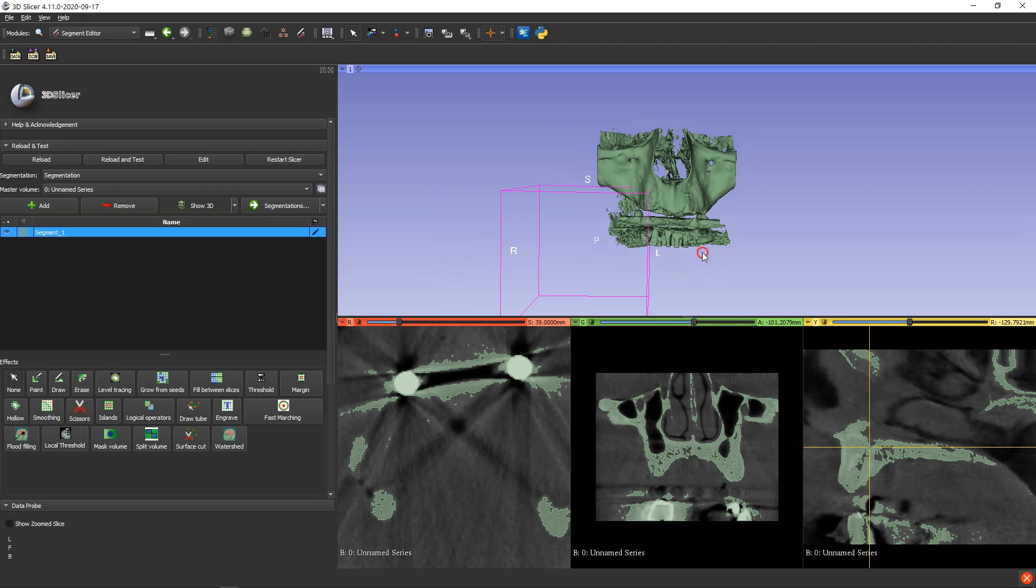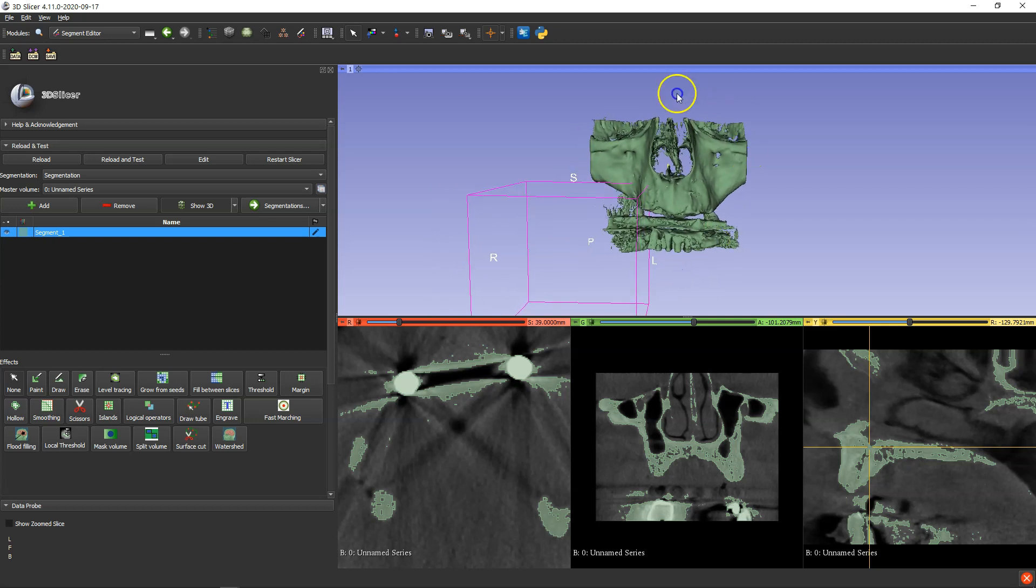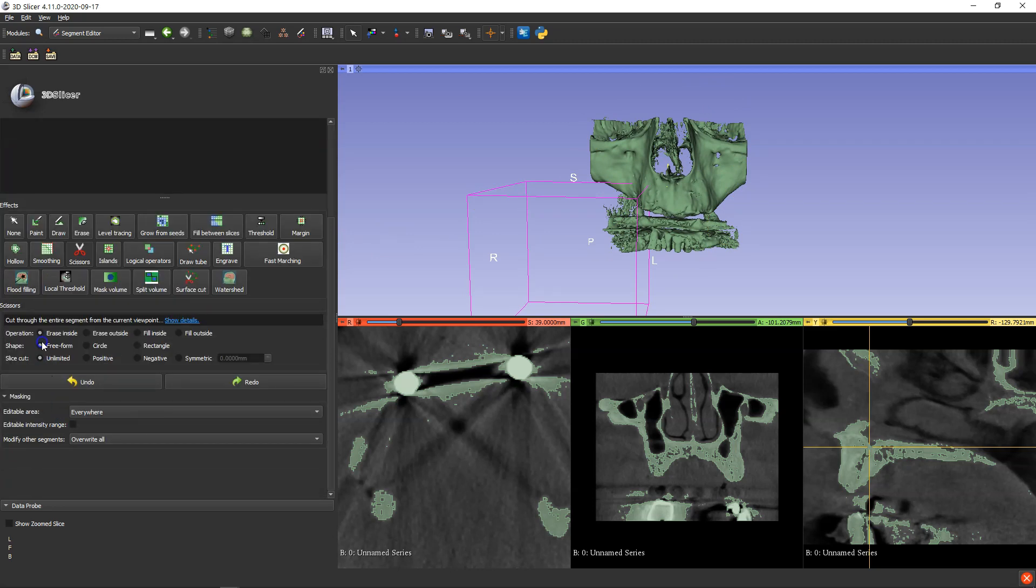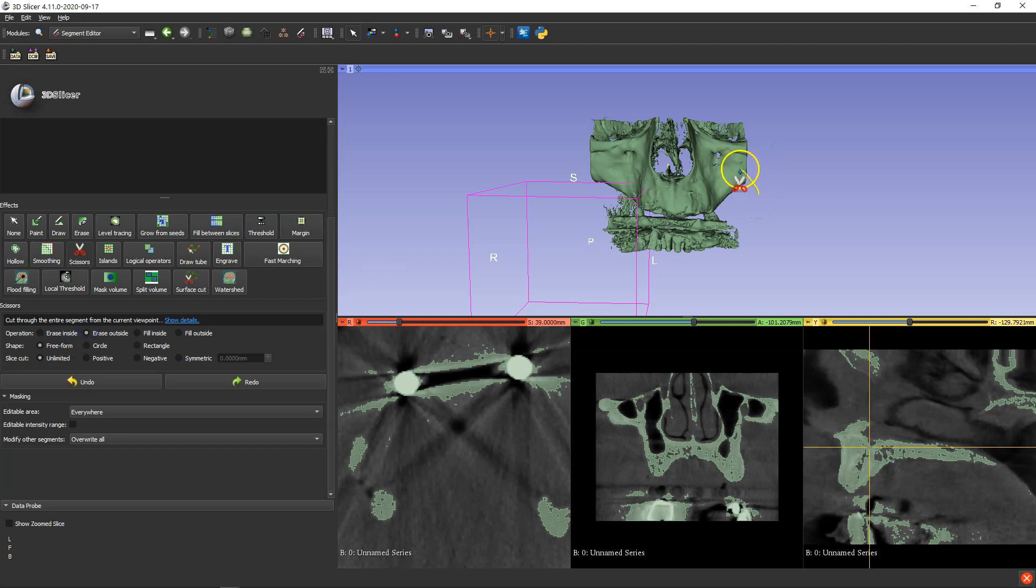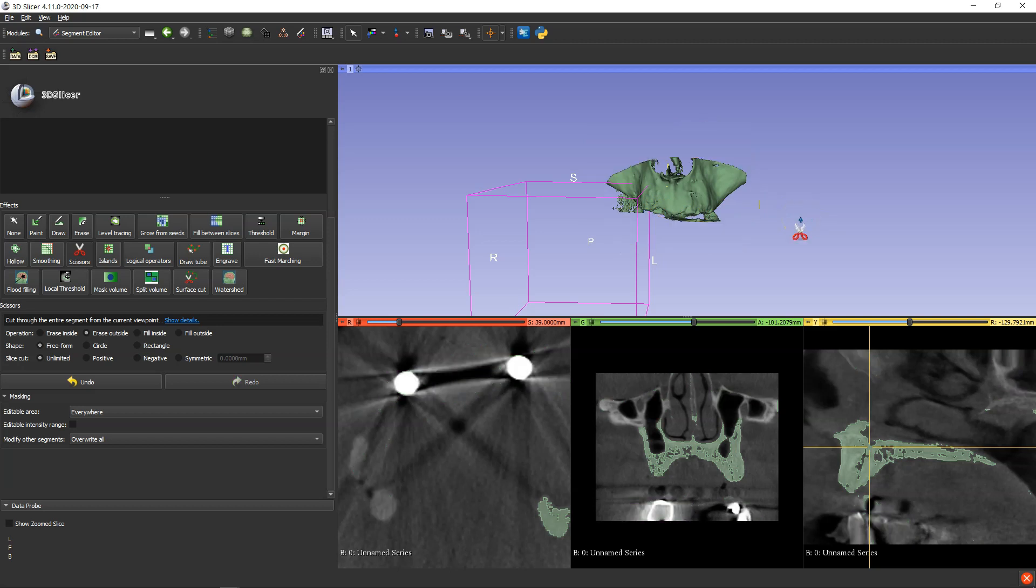But before I do that, we're going to clean up the segmentation model. Simply click on the scissors and then get to choose either erase inside or erase outside. We're going to click on erase outside for now. So I'm going to be making myself a little model just big enough so we can work with it and let it do its thing.